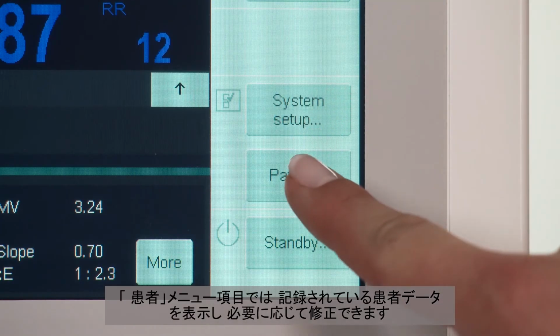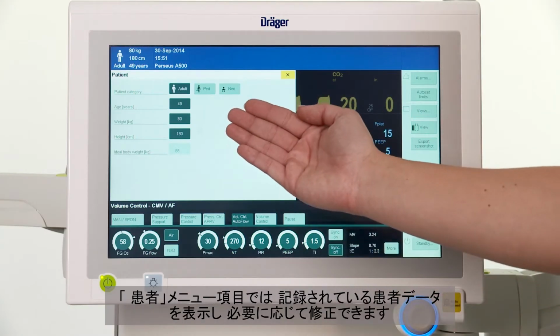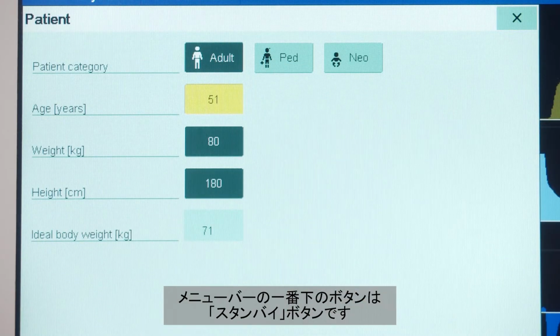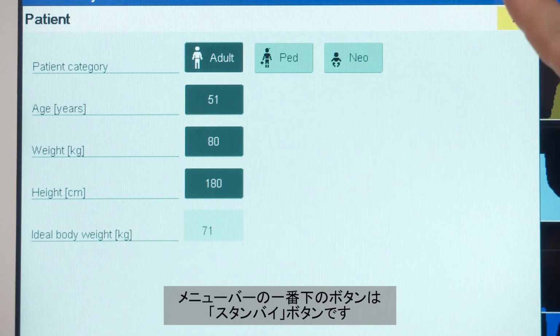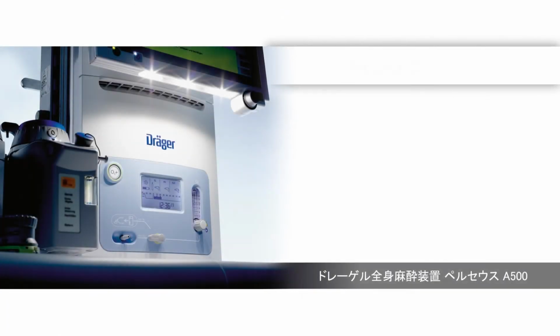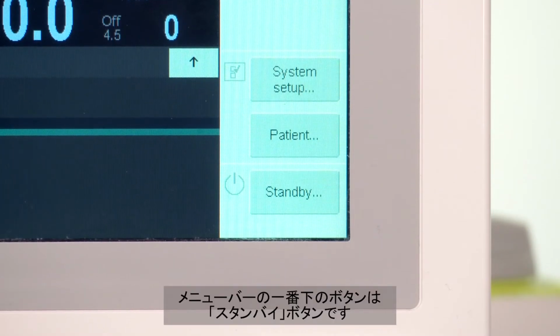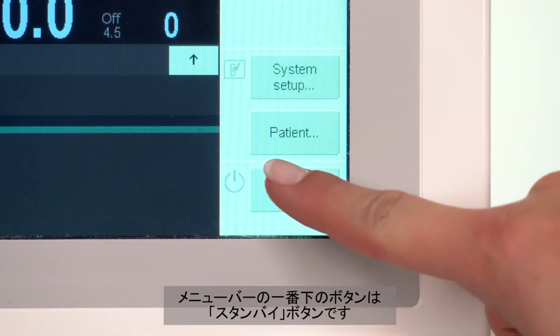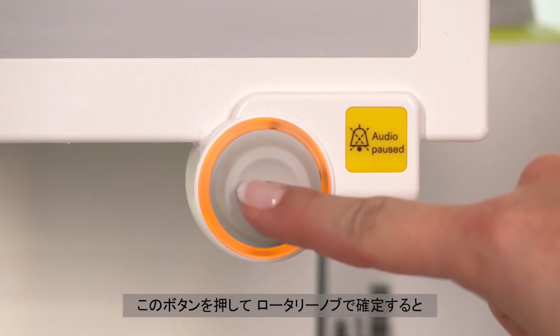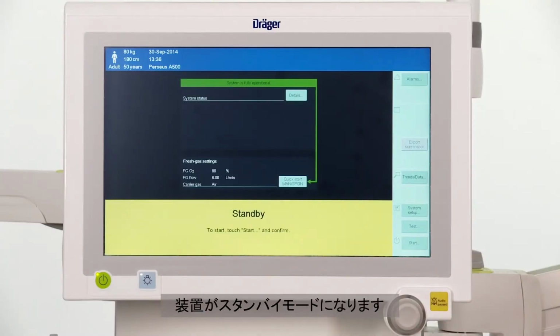The menu item Patient allows you to view the recorded patient data and correct it if necessary. The button at the very bottom of the menu bar is the Standby button. Pressing this and confirming your selection with the rotary knob will let the device go into standby mode.